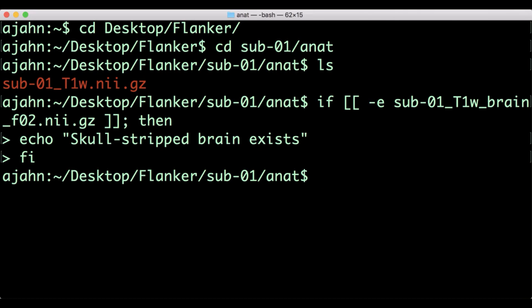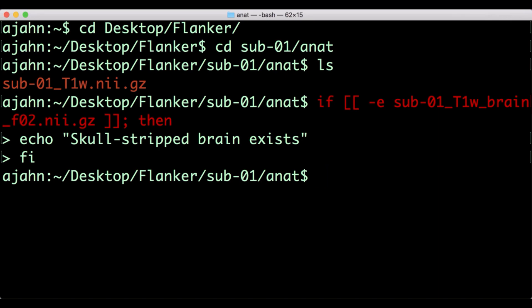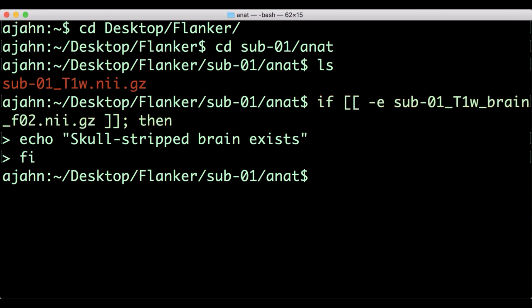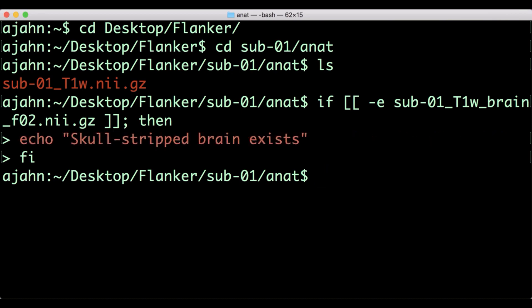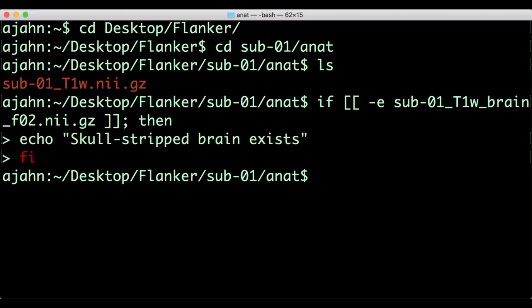As with the for loop, a conditional statement has three distinct sections. The first section begins with the word 'if', and then evaluates or checks whether the statement within the brackets is true or false. Within the brackets, the dash e means check whether this file exists. If the file does exist, then the statement goes on to run the code in the body of the statement. You can have as many lines of code in the body as you want. The last line, 'fi' — or 'if' spelled backwards — ends the conditional statement.